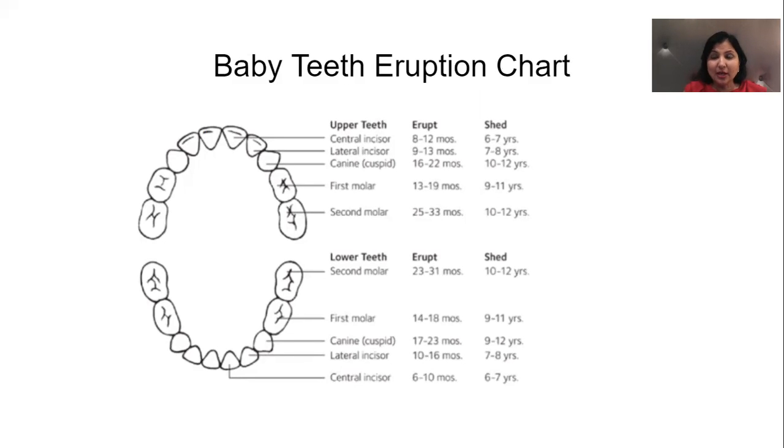So in this case, we are going to try pulpectomy if possible. If the pulpectomy doesn't work, then you extract the tooth and then you go ahead and make a space maintainer. Most of the time I make a band and loop space maintainer because the first molar has erupted pretty well. By the time we have done extraction and all, the patient is 7 plus, it's fully erupted. We put the band on the first permanent molar and it's good to go. So that is a scenario in case of this.